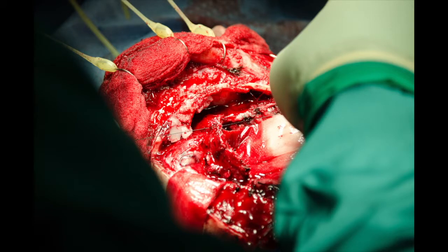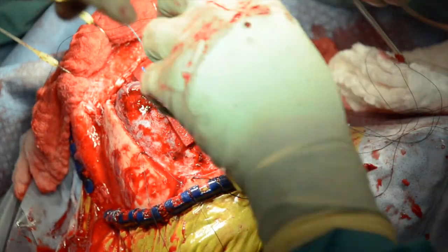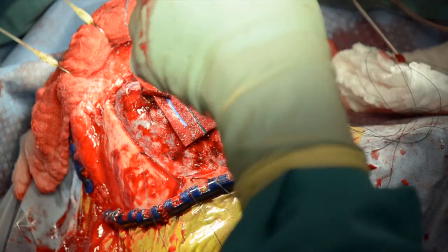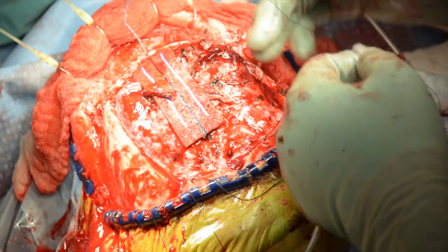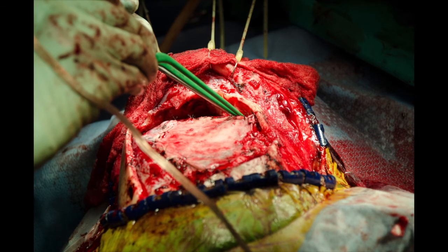Closure begins after meticulous intracranial hemostasis is obtained. At this point, a primary dural closure is attempted. The dural stay sutures are cut, and a cottonoid is placed on the brain surface below the dural edge to prevent blood from collecting in the subdural space. The subdural space is filled with irrigation prior to the placement of the final stitch.